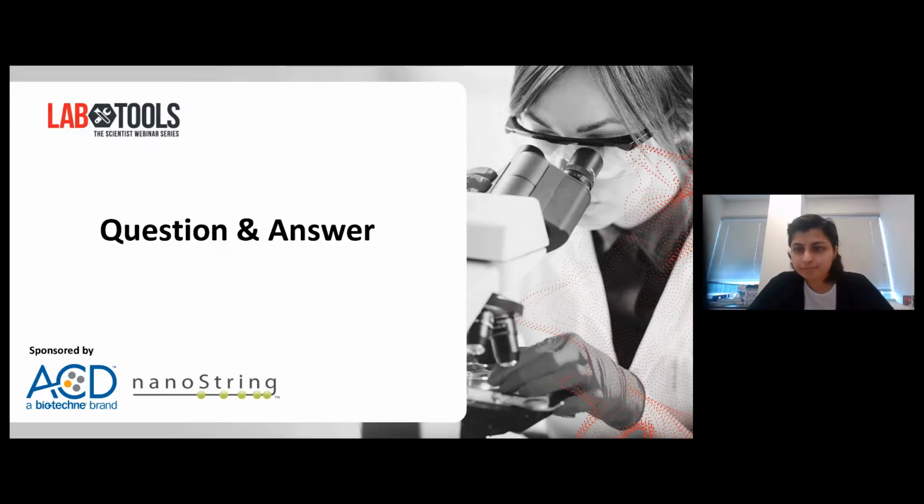Yeah, I think I can maybe take this. After you do the staining with the RNAscope probes and the GeoMx RNA assays, you'll be presented with the image of the whole slide. And so that scanning, the setup and scanning takes just about an hour. And so you have that image. And then you can select the regions of interest.